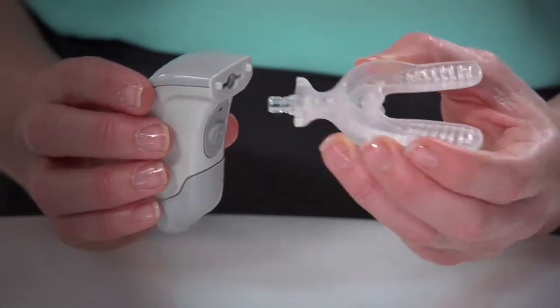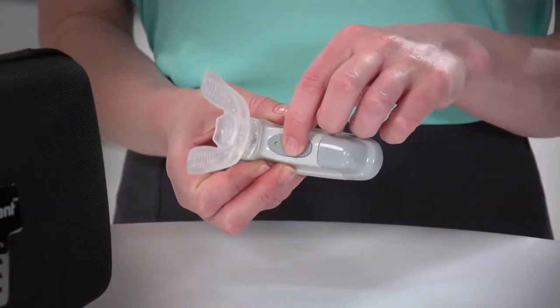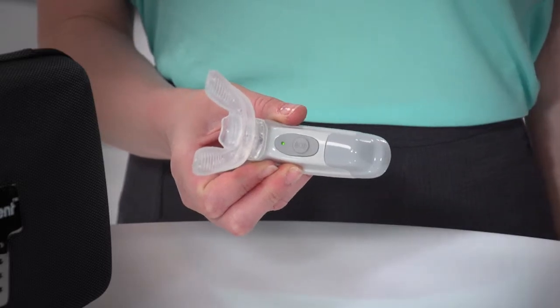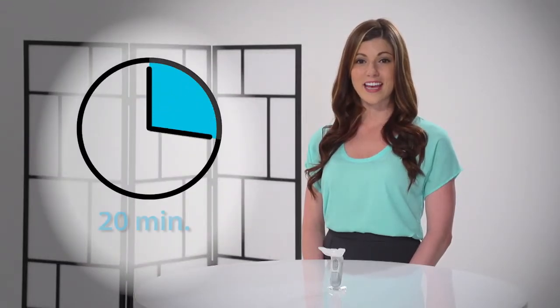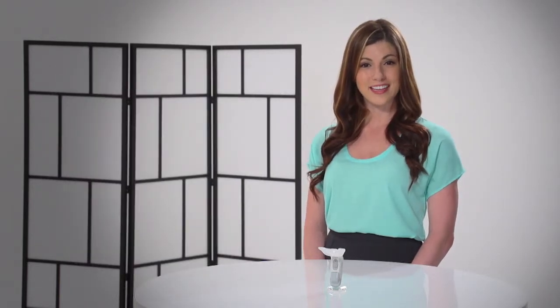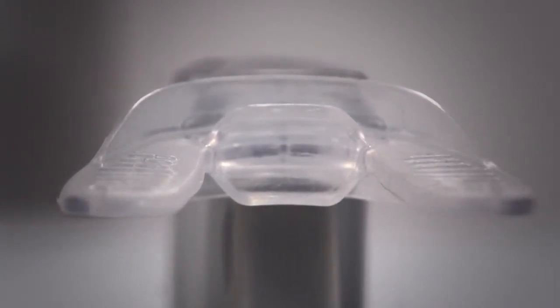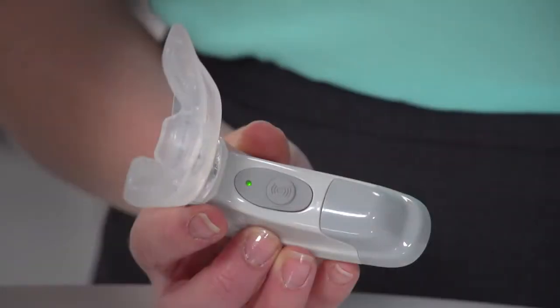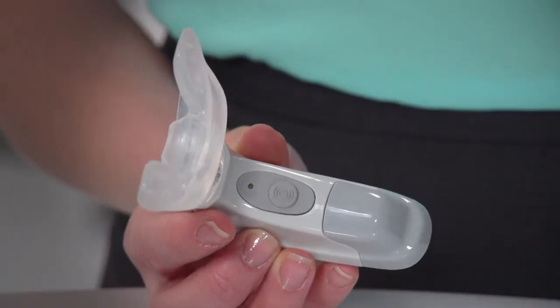Insert the mouthpiece fully into the activator, then press the power button. Excelident requires only 20 minutes a day of continuous use. When used continuously for 10 minutes, 3 short stuttered micropulses will let you know you have reached the halfway point. At the end of 20 minutes of continuous use, the unit will automatically power off.